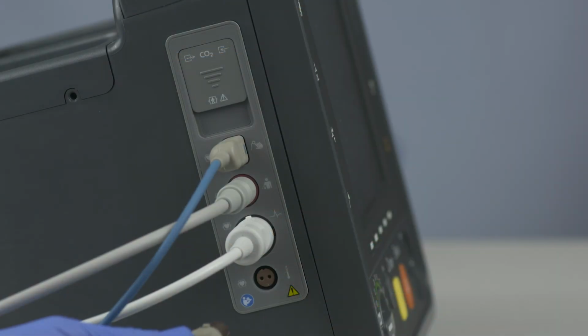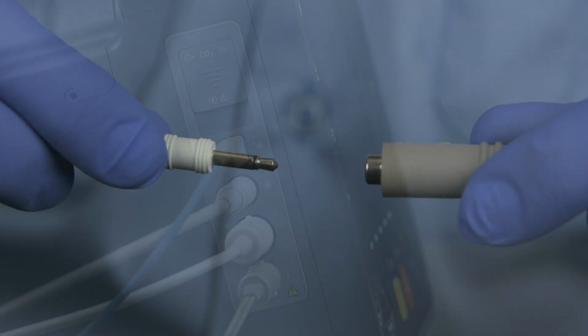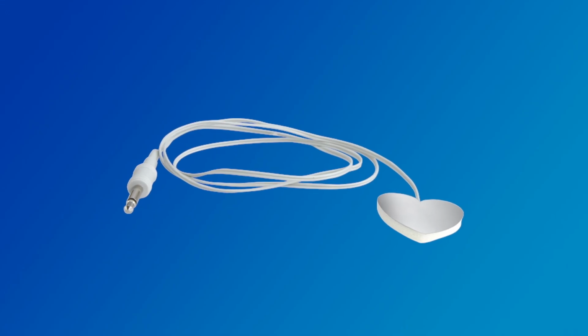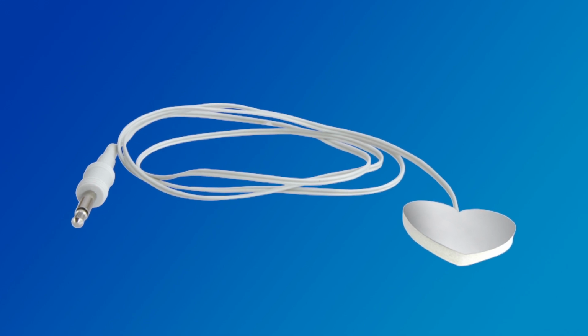Reusable probes connect directly into the brown port on the left side of the device. With disposable probes, you connect the temperature cable to the HeartStart Intrepid and then connect the disposable temperature probe to the cable. In this case, we're using a disposable temperature probe. Apply the temperature probe to the patient.